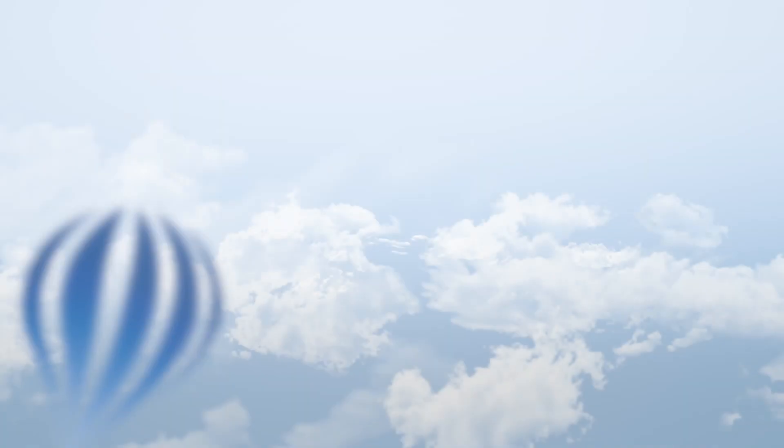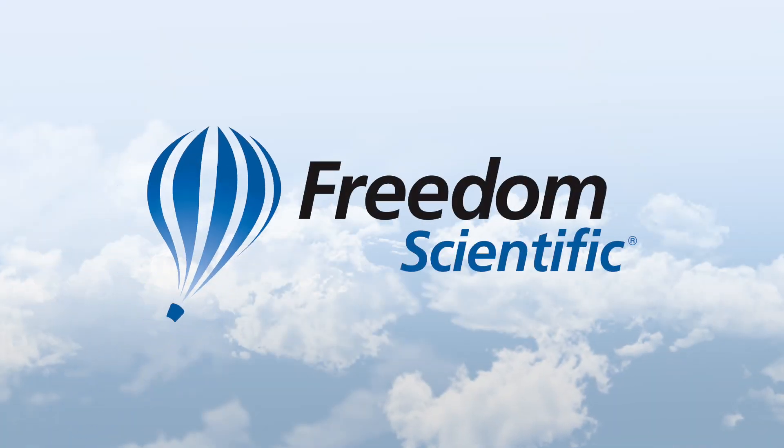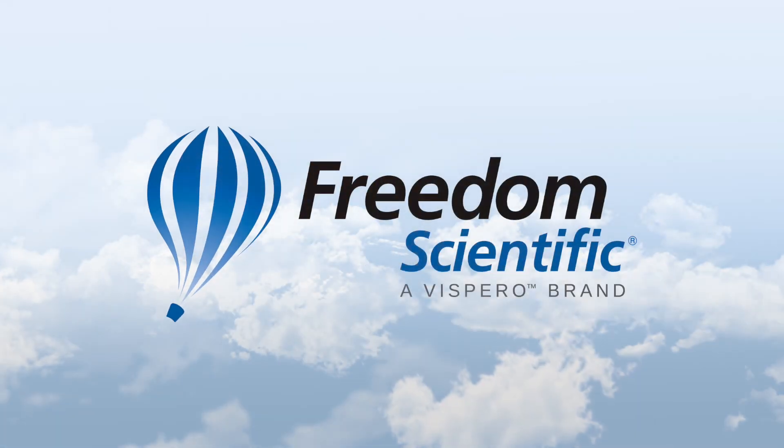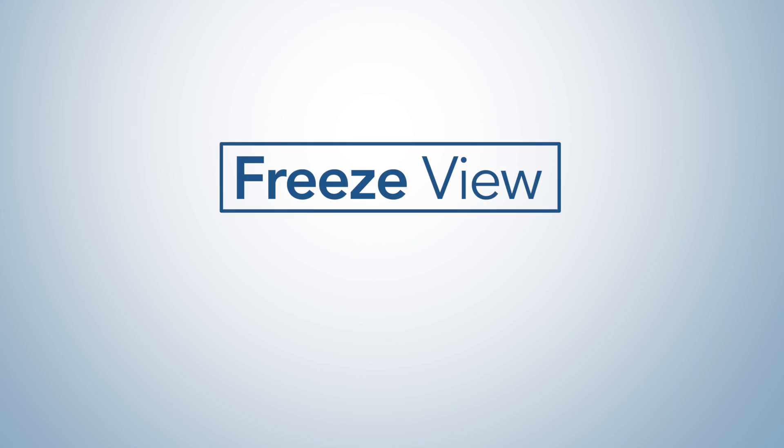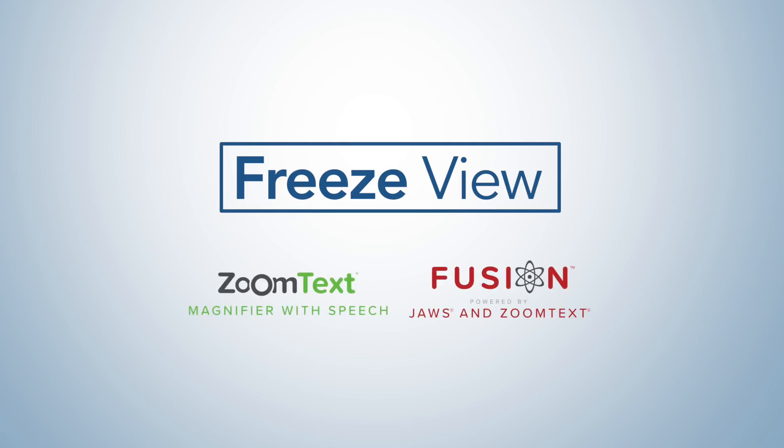Take your screen magnifier experience to the next level with the new and improved FreezeView feature, available for ZoomText and Fusion 2023.